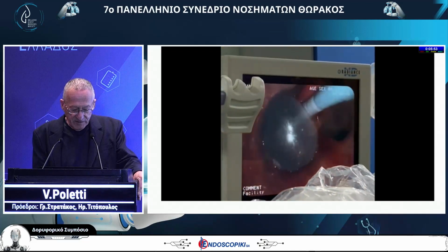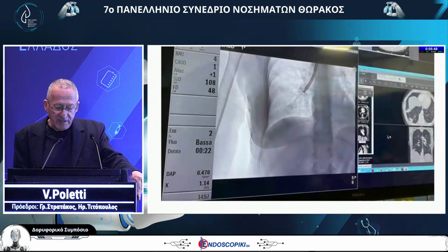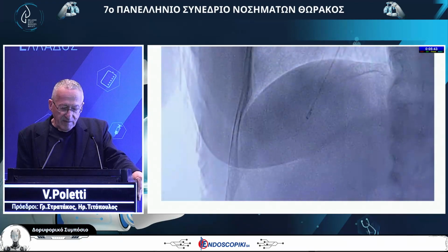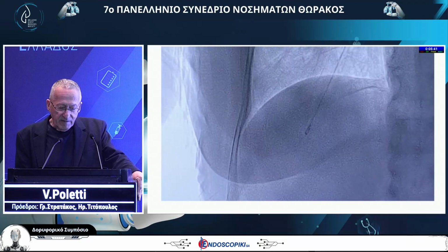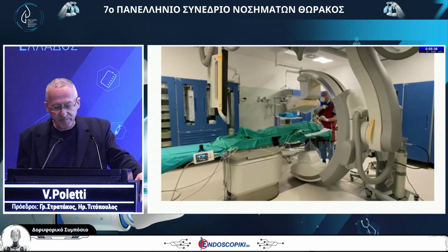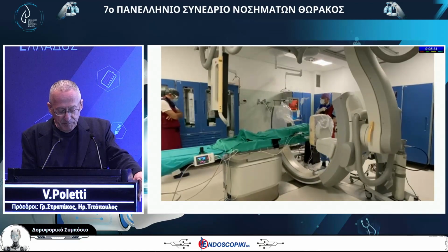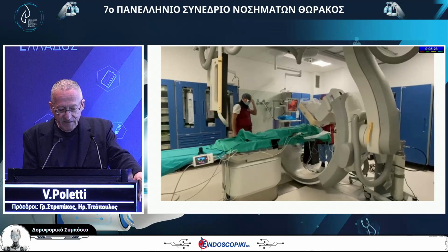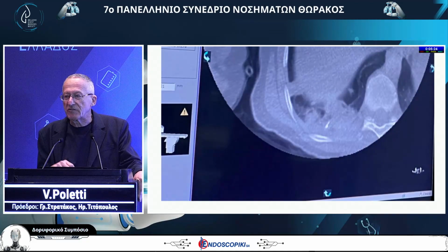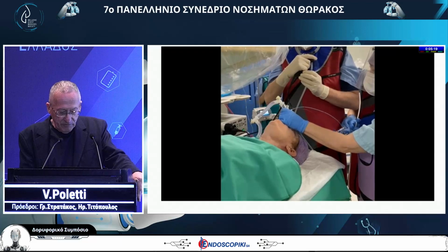breathing spontaneously, because this was a prospective study, we inserted 2 Fogarty balloons, fluoroscopy, assessment of the probe, and then a CT scan guided approach. It's not important to avoid atelectasis. What is important is to know if you are in the real periphery and you perform the biopsy in that way.